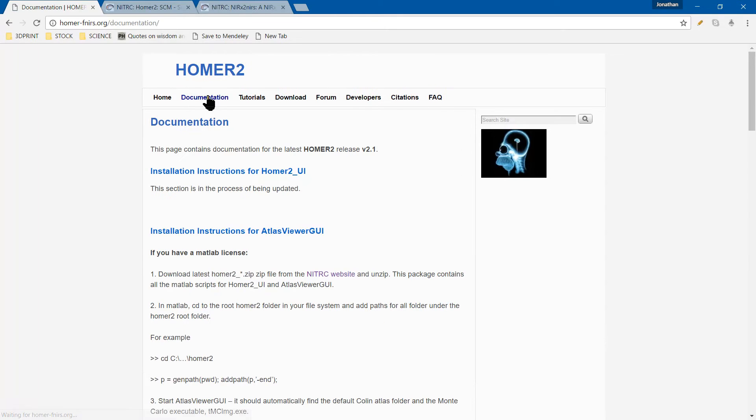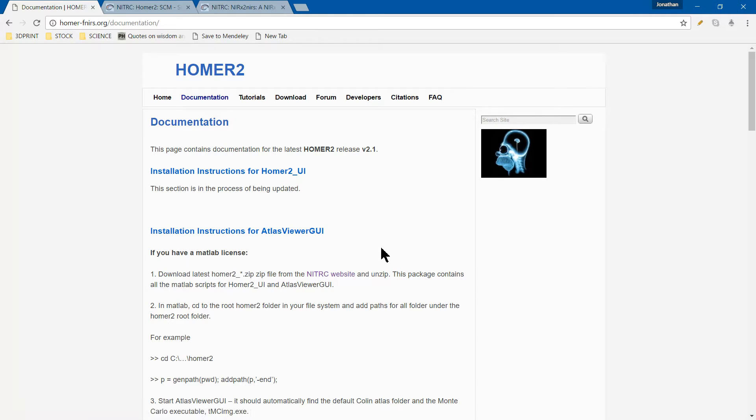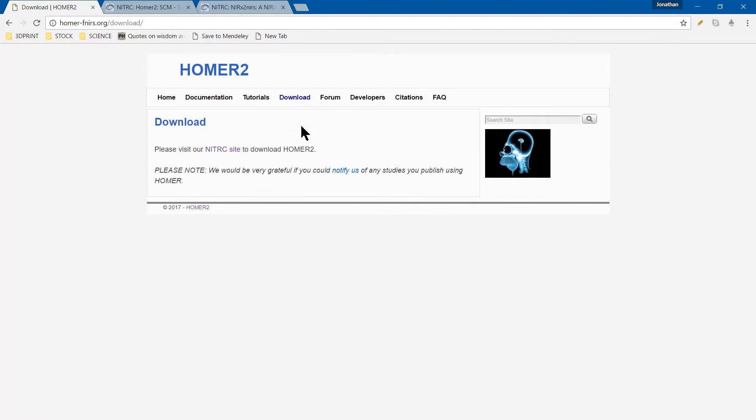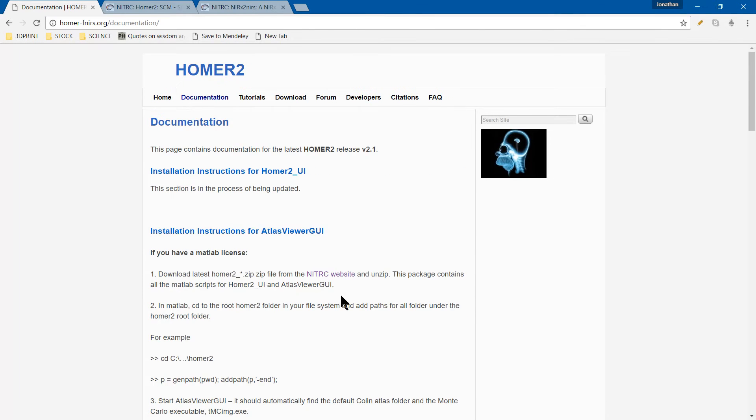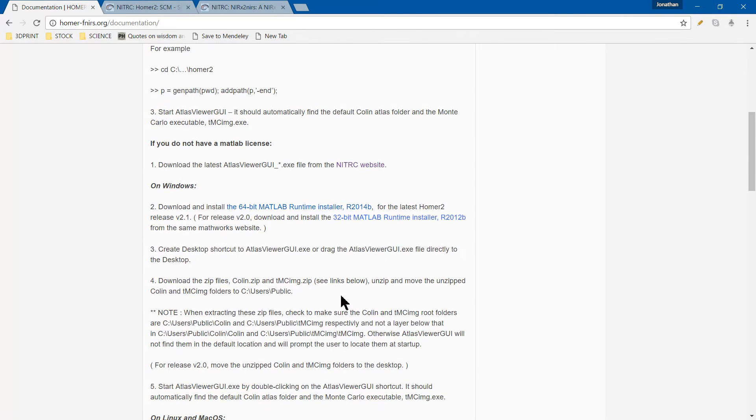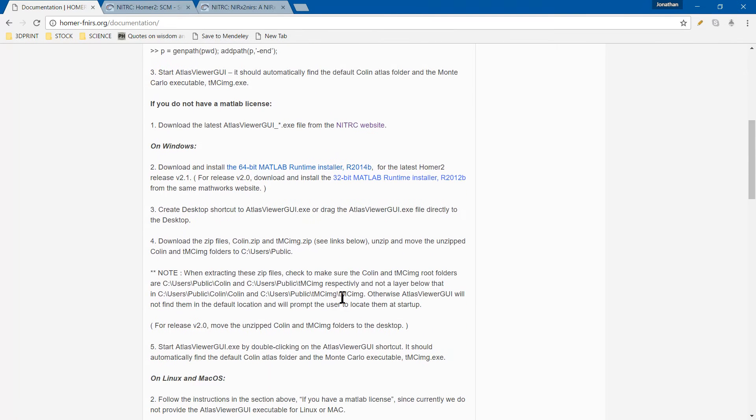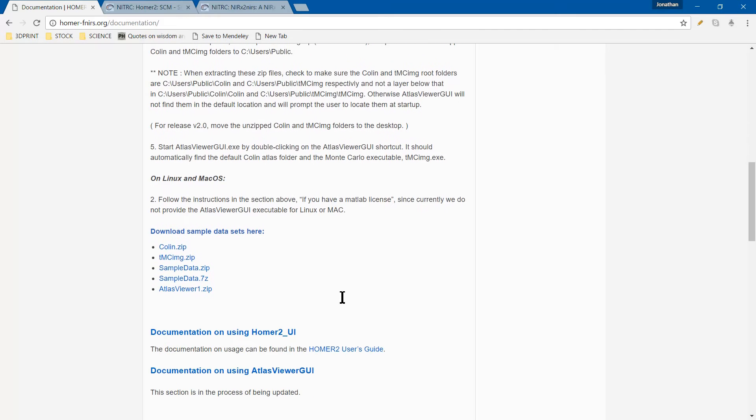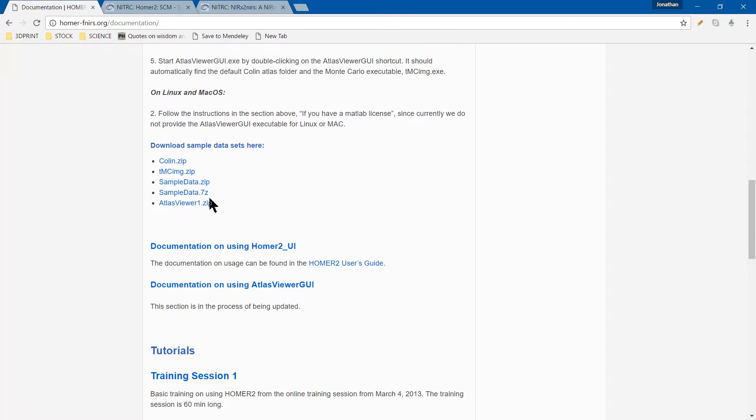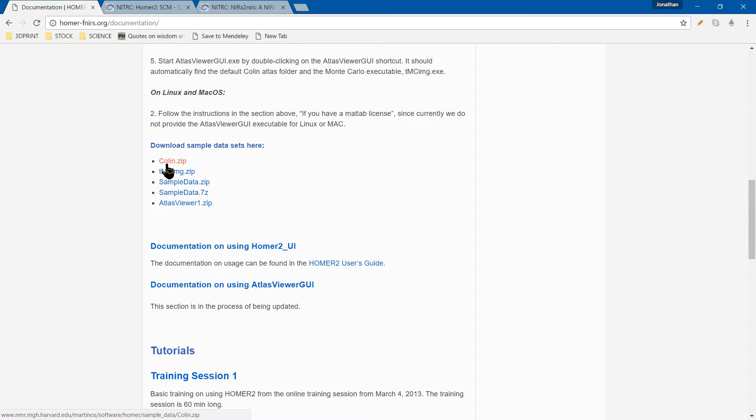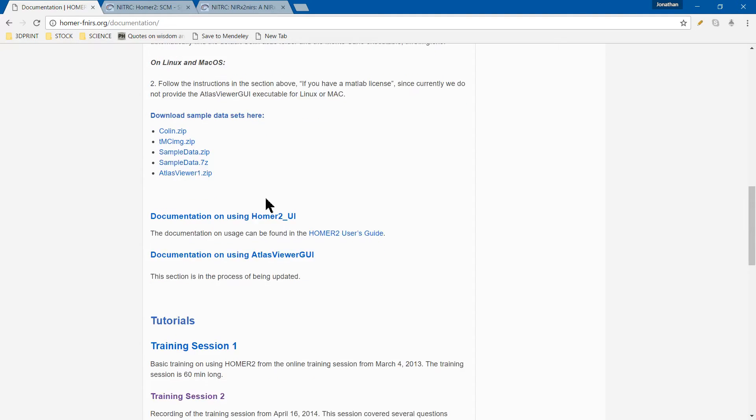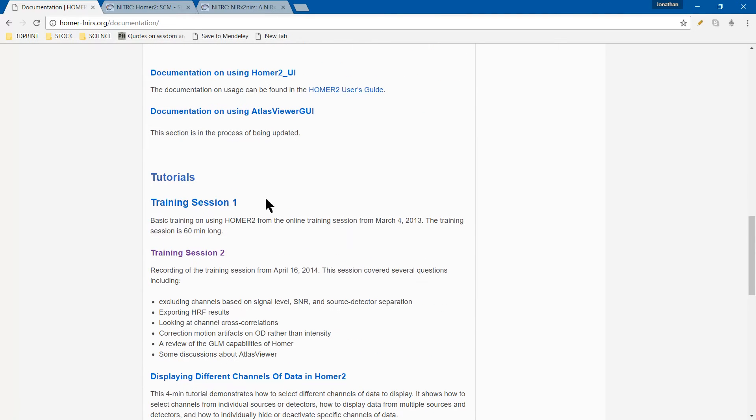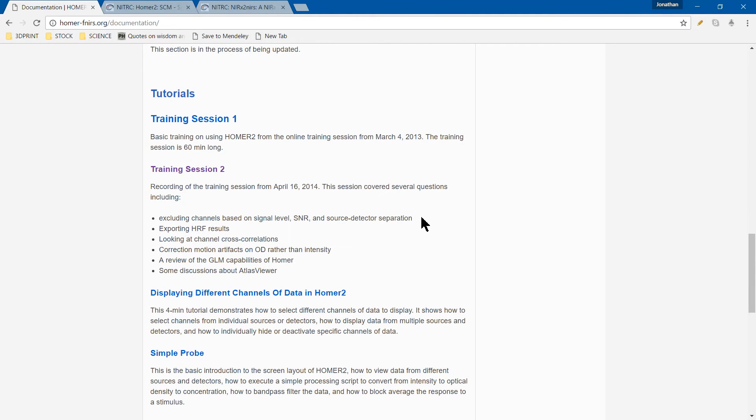In the documentation tab, there's actually a link to download the file, so download basically has the same link. But documentation also has info on what's included: sample data, Colin (one of the atlas heads), and Atlas Viewer 1. The tutorials are also in this tab, which is a little redundant.